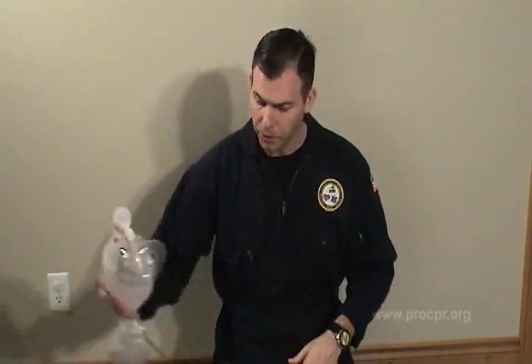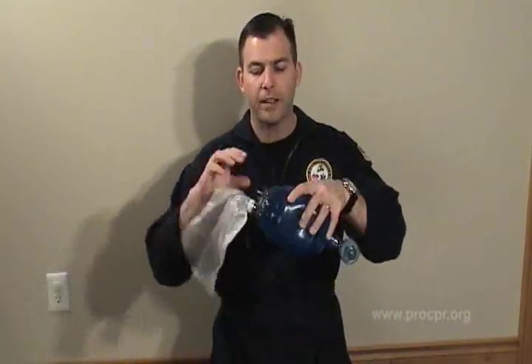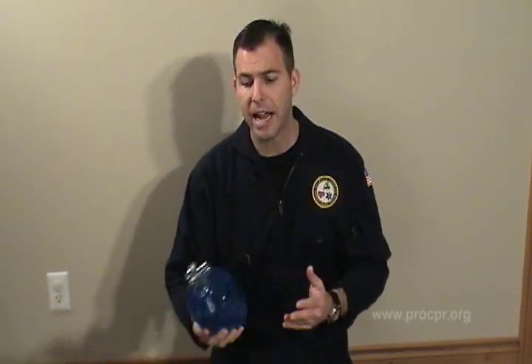You'll get a better seal and better delivery of oxygen even without supplemental oxygen than you would with a bad seal. If you don't have supplemental oxygen, you may want to revert back to a bag valve mask system where you can basically take off the reservoir and simply use room air. 21% oxygen is great. We can deliver that oxygenation to that patient in respiratory arrest or respiratory distress and not have to worry about desatting the patient because we're drawing off from a collapsed reservoir and not getting them any oxygenation.